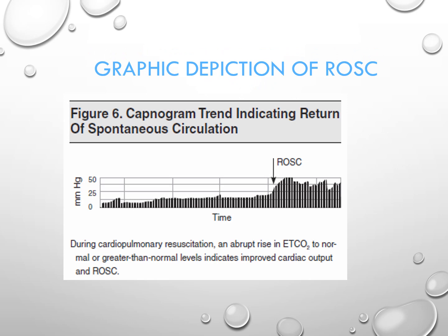So when the resuscitation team, during a code blue, during CPR, advanced cardiac life support, is doing compressions on the patient, under the best of circumstances, those compressions are emulating about 25% or so of perfusing pressures. So certainly nothing that approaches normal, but potentially adequate to maintain cerebral oxygenation, all right? And one of the ways we could determine the quality of compressions, as I was alluding to earlier, is by looking at waveform capnography.